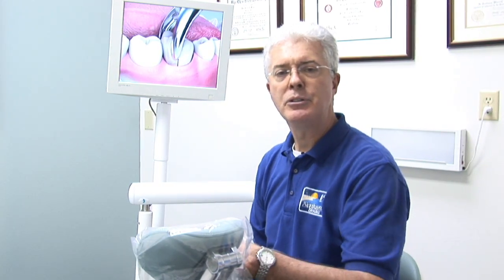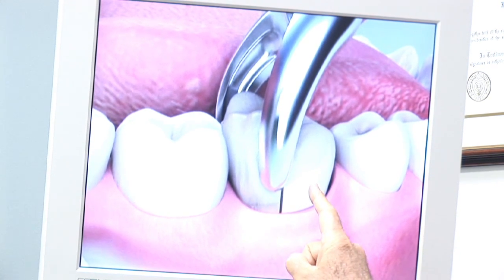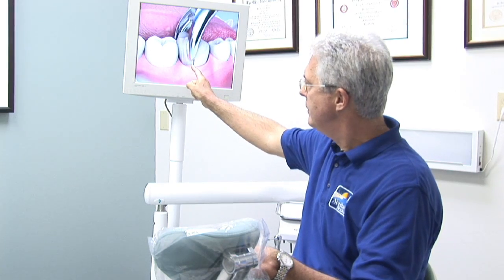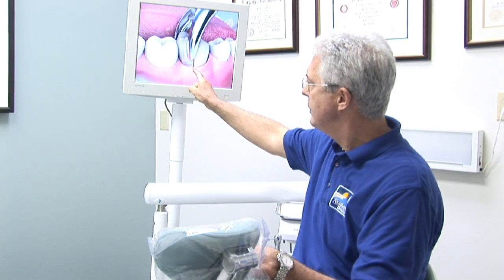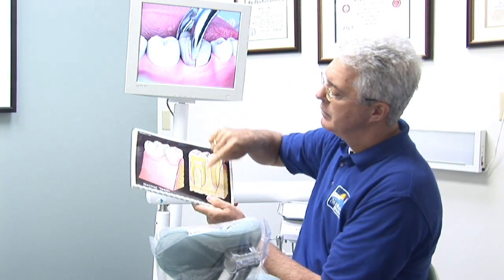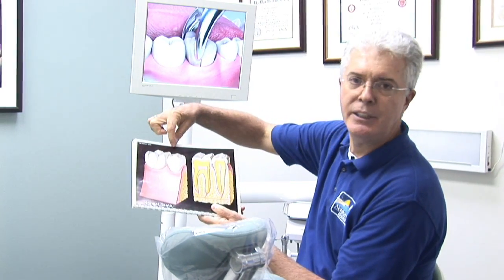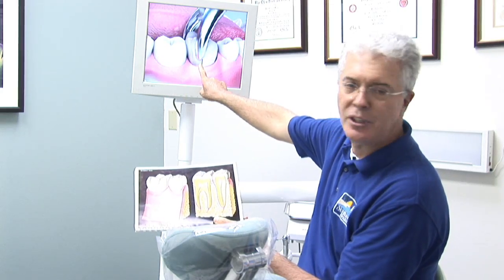Sometimes though, we have to do what's called a surgical removal. Here, we actually put a split down through the tooth and then we can take the tooth out half at a time. If there's two roots, you would split the tooth in the center and take out one half in one direction and the other half in the other direction, and that's what's being shown here.